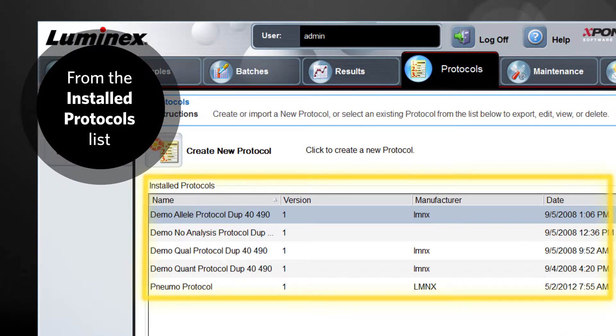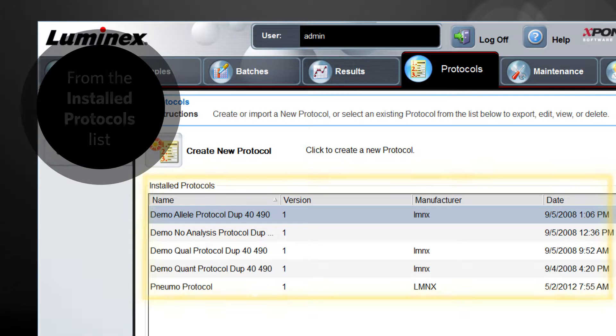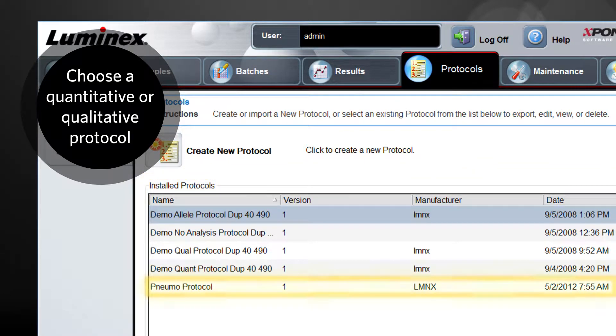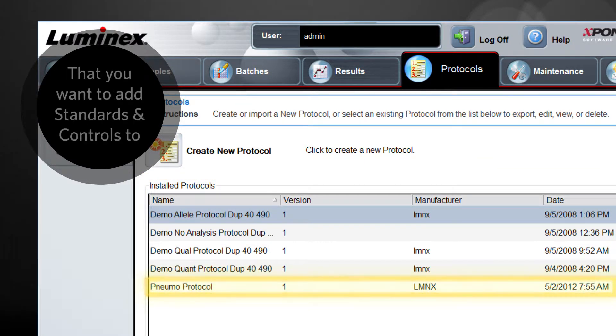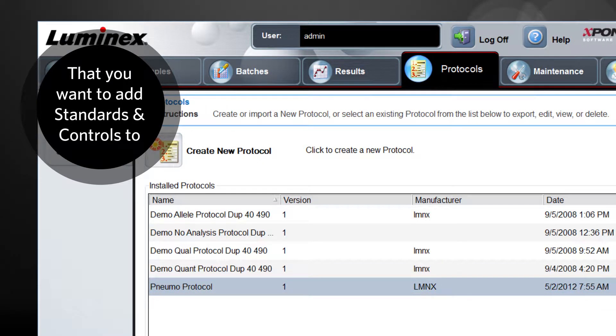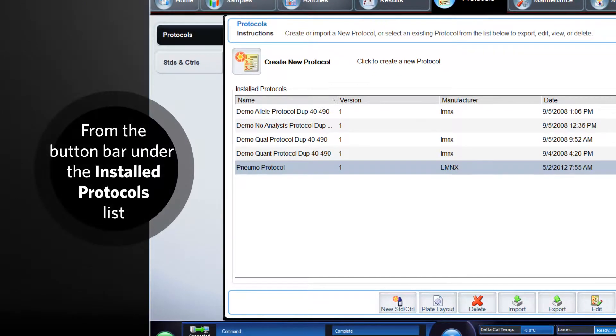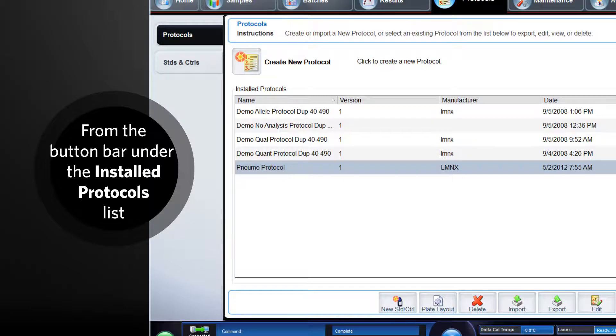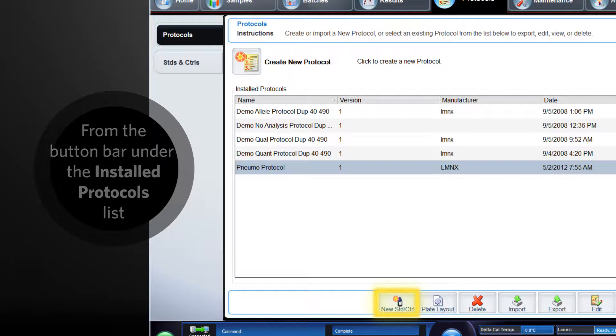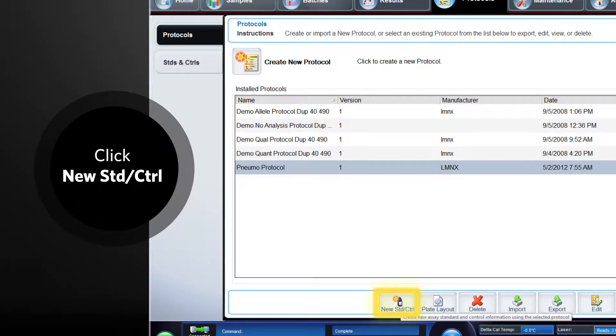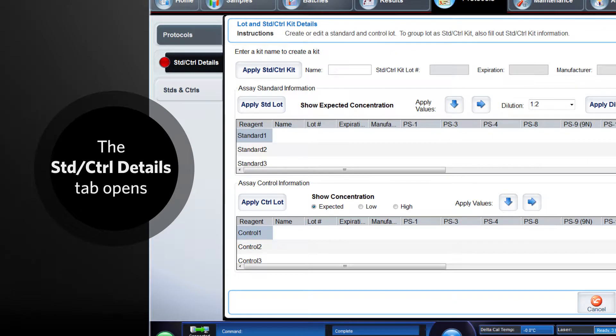From the installed protocols list, choose the quantitative or qualitative protocol you want to add standards and controls to. From the button bar under the installed protocol list, click new standard control. The standard control details tab opens.